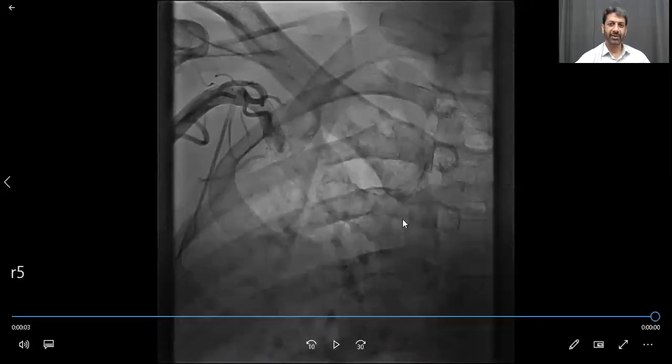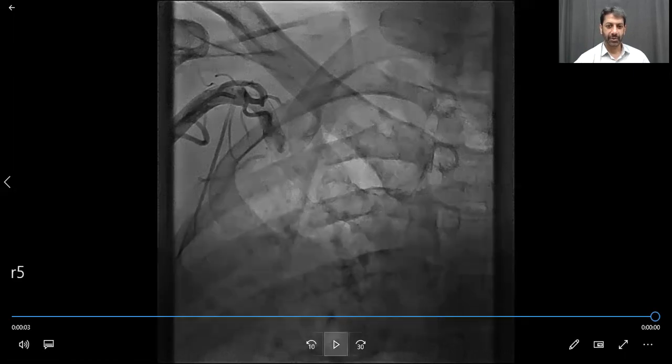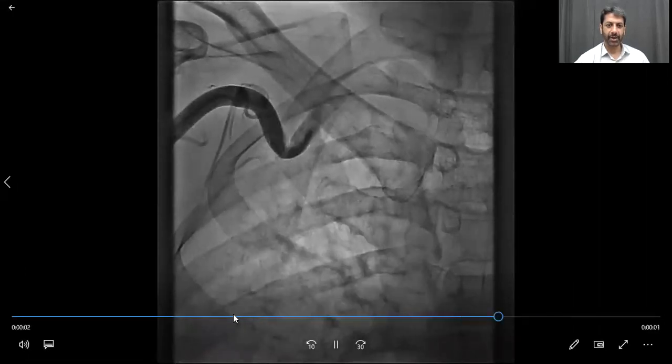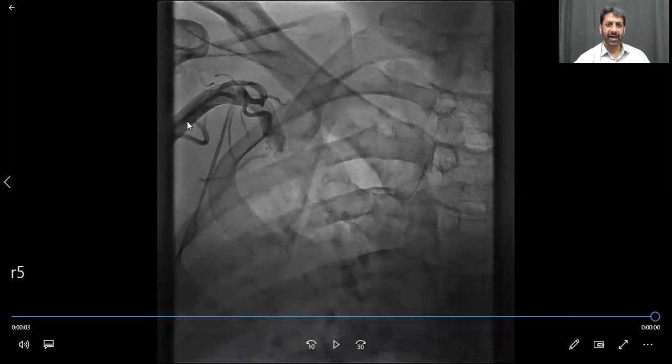and I asked a question: a cardiologist is going for a coronary angiogram through radial route. So what's the problem he faced and how to overcome? So here, if you see, the problem is very clear, and some of you have answered very rightly that the problem here is that he has difficulty in passing the catheter from this place.